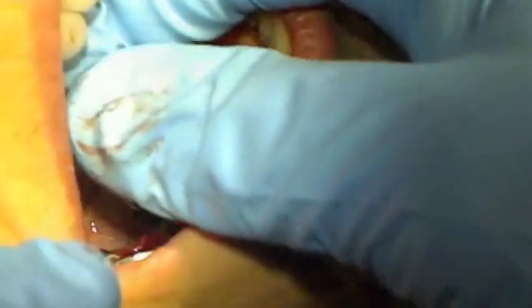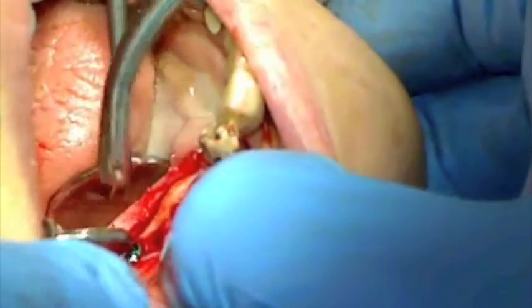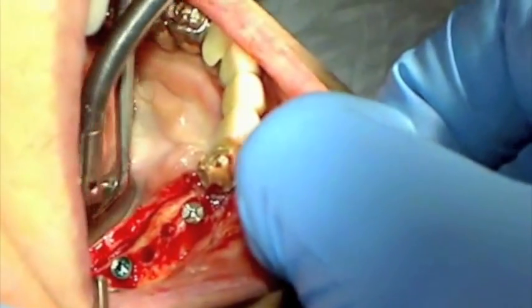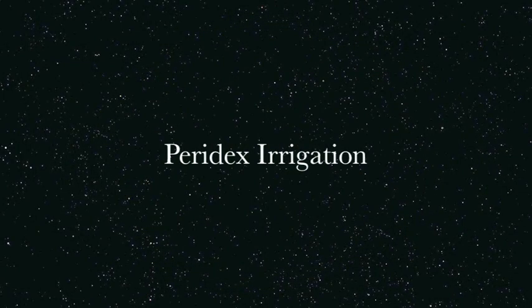The Legacy 3, 8 mm implants are then transferred to their respective osteotomies. The internal hex of the implant is then irrigated with chlorhexidine to prevent post-surgical fistulation.